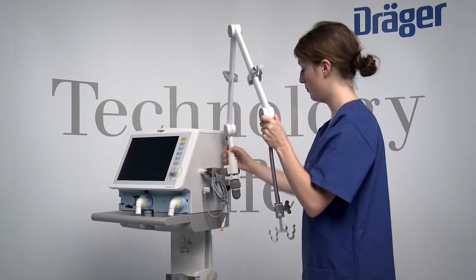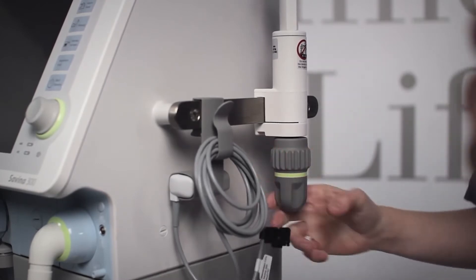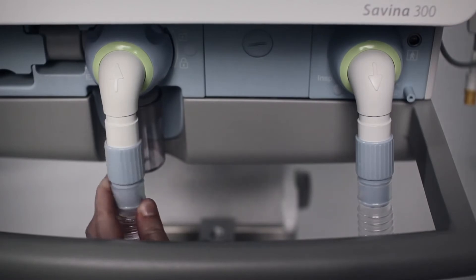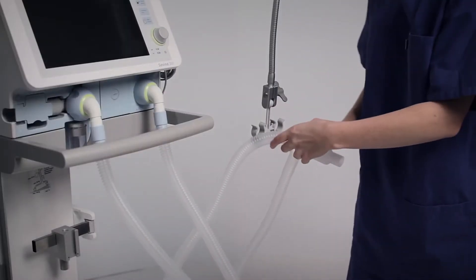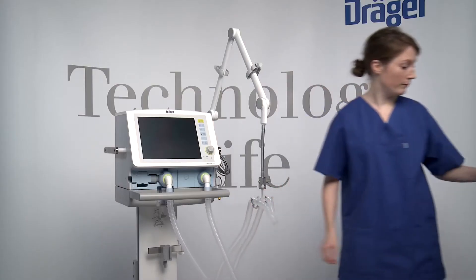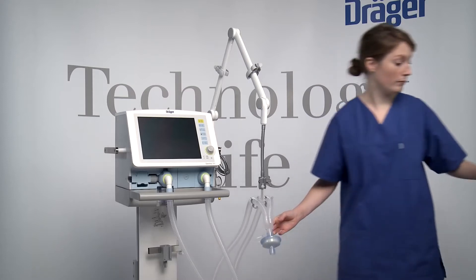Hang the hinged arm on the lateral standard rail of Savina 300 and tighten the screws. Connect breathing hoses to the inspiratory port and to the expiratory port. Insert the breathing hoses in the opening of the hinged arm, then the HME on the Y-piece and the test lung on the HME.